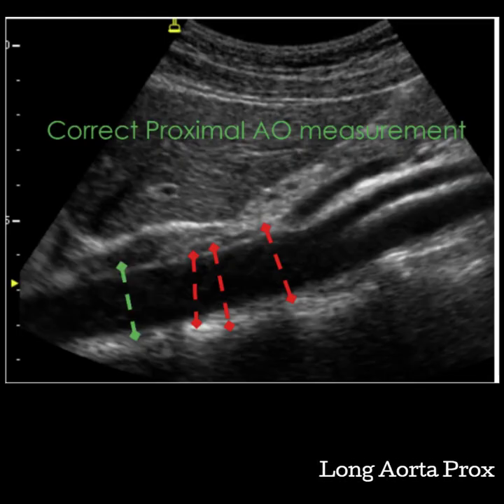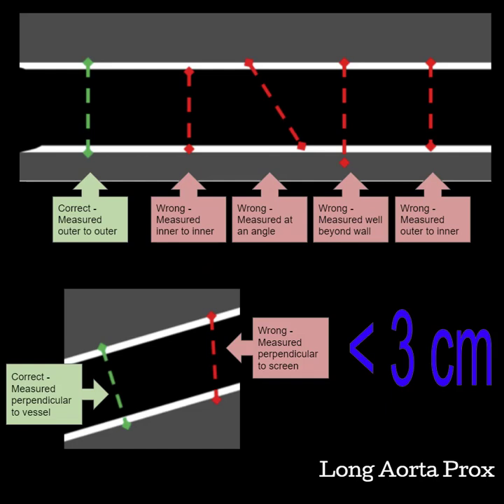Measure the proximal aorta as close to the heart as you can where you have clear walls. The walls can become distorted due to lung and heart motion, as well as proximity to the left diaphragmatic crux. Avoid being too close to the celiac axis or measuring into the spine. The aorta's anterior-posterior dimension is measured outer to outer wall and should be perpendicular to the vessel. The aorta should measure less than 3 cm in any direction. Larger than 3 cm indicates an aortic aneurysm or enlargement of the aorta.